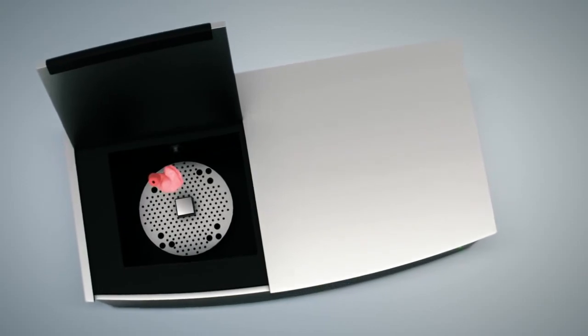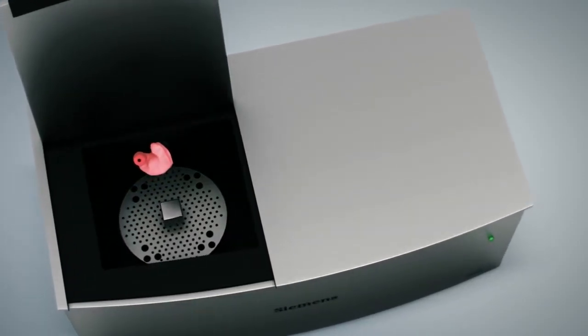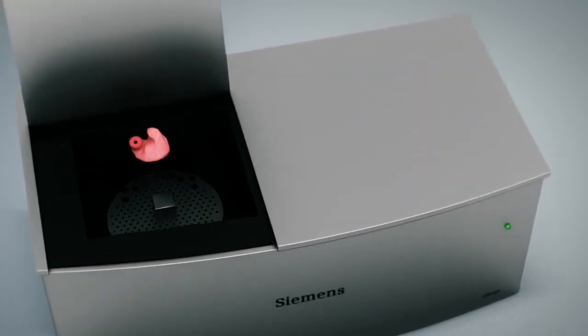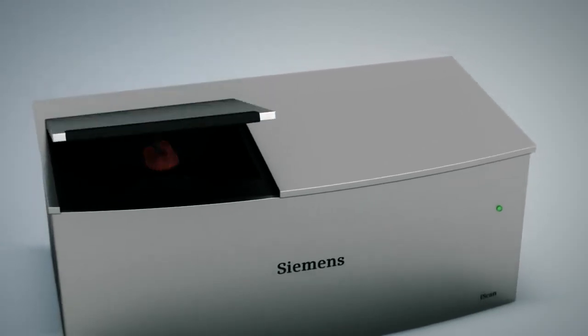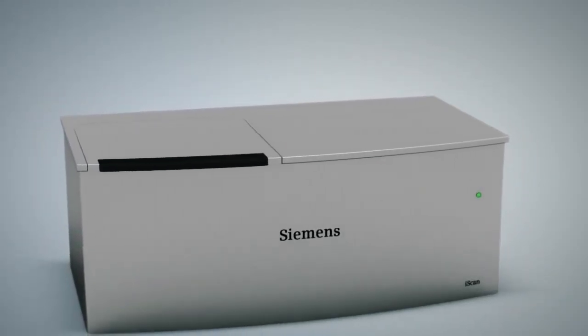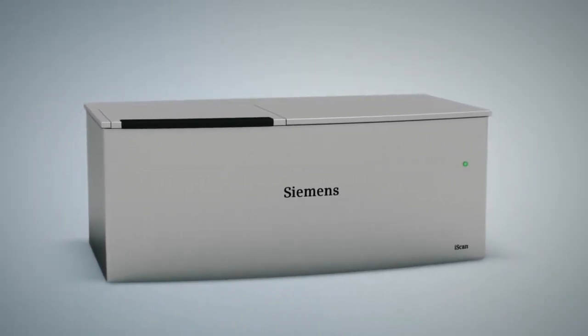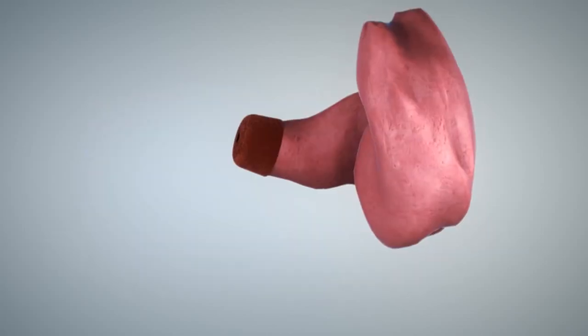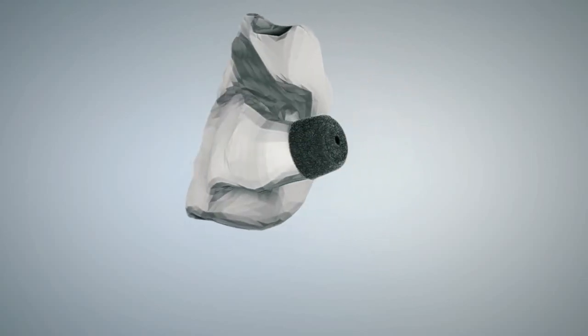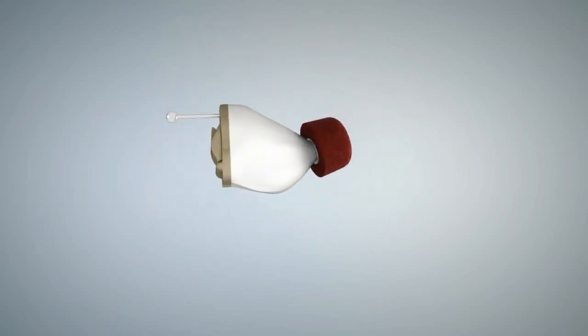All that's left to do now is to send the ear impression, including the dome, to your manufacturer. As an alternative, you can scan the ear impression using the Siemens iScan. The soft dome of Eclipse XL will be positioned at the exact same spot as the impression dome. This means there will be virtually no occlusion.